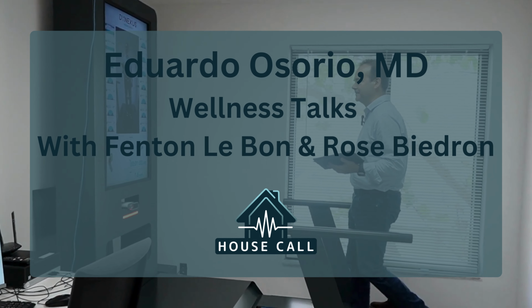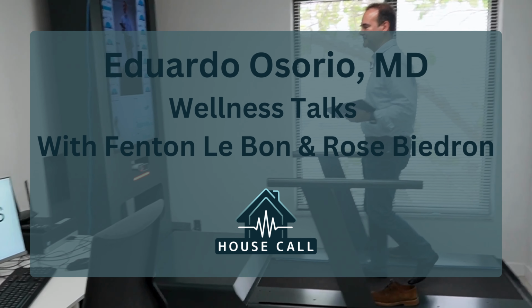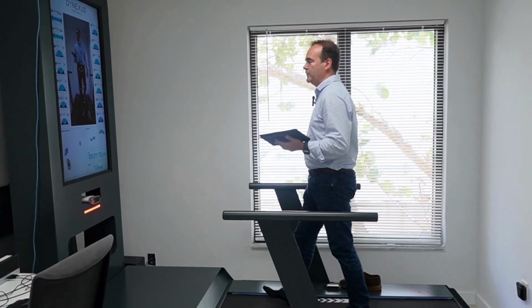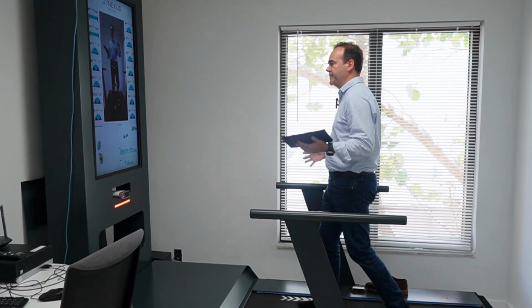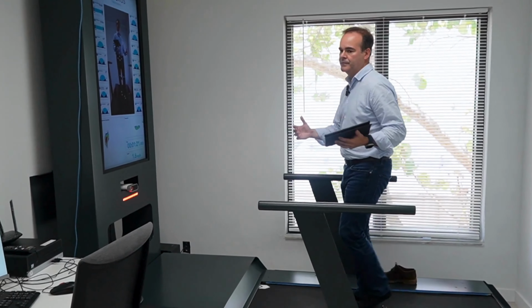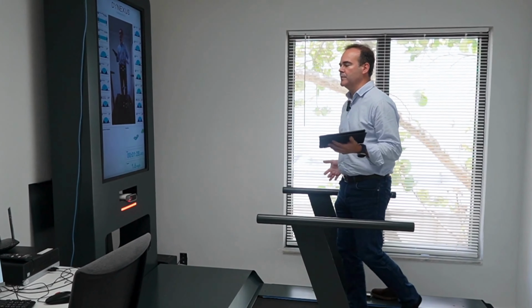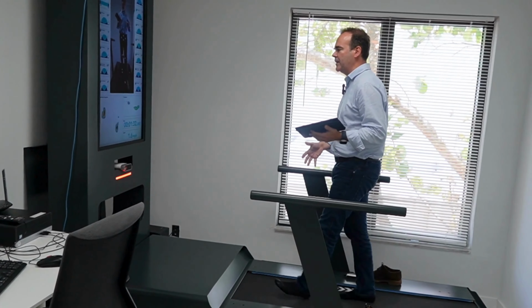So we're here with Eduardo. He's on his very own machine, and he's going to explain a little bit about exactly what he's doing. Eduardo? Yes, when we try with this machine, what we do is analyze the whole body, how it's moving in the space. Then we can measure the angles, the speed, and the degrees that we are moving in our inversion: the spine, knees, hip, ankles.